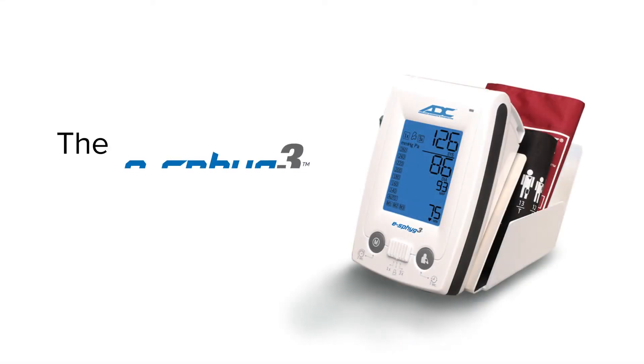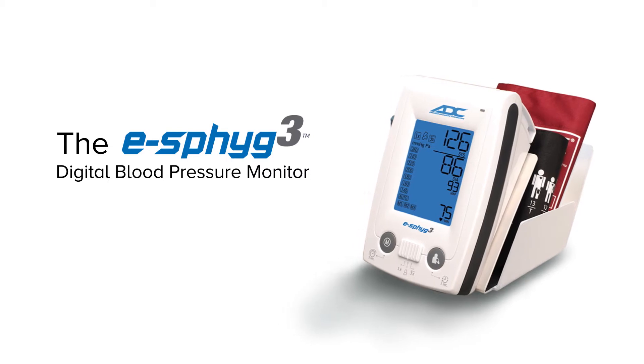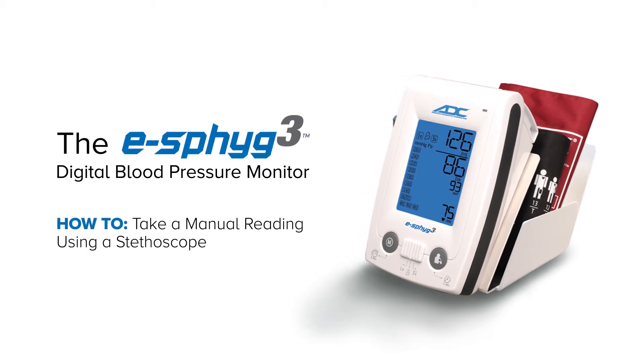ADC's all-new eSFIG3 is a feature-packed, professional-grade NIBP monitor with three clinically validated modes, including single measurement mode, customizable average mode, and manual mode. In this video, we'll show you how to take a manual reading using a stethoscope.